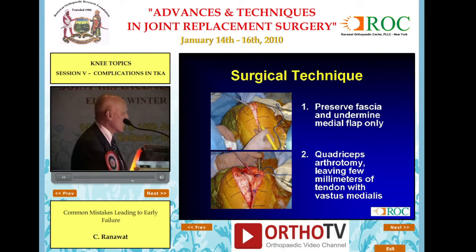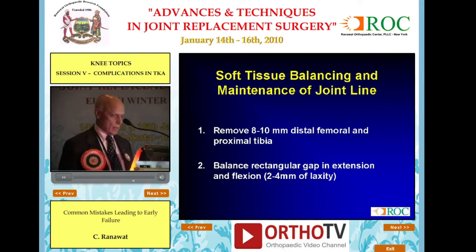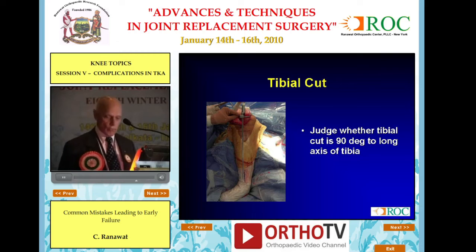If you go that way, you will have a hard time balancing the patellofemoral joint. All right, rectangular gap I talked about, and this is an important slide that puts the tibial tray covering the cut bone, and this rod should come in the middle. If it doesn't come in the middle, your cut is off.